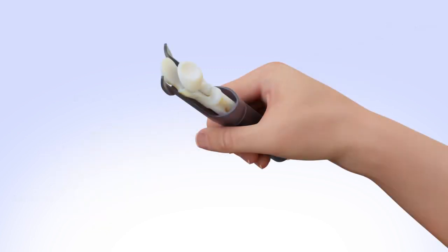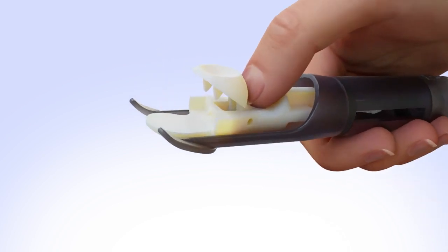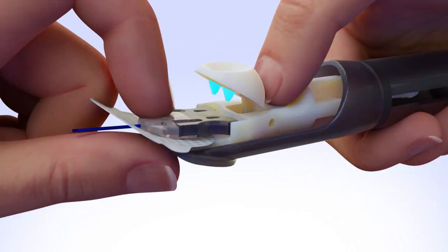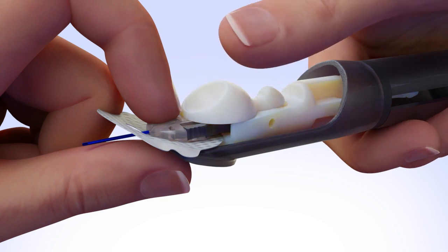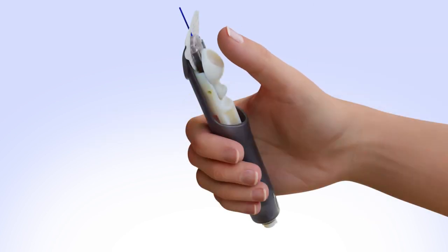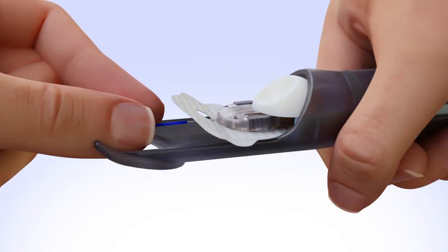To load the infusion set, press down on the lock and release handle, exposing the 2 teeth. Place the insertion piece into the base until the holes line up with the teeth. Release the handle to lock the insertion piece in place. Use your thumb to slide the serter back into the loaded position. You should hear a click and feel it lock into place. Gently pull off the blue needle guard.